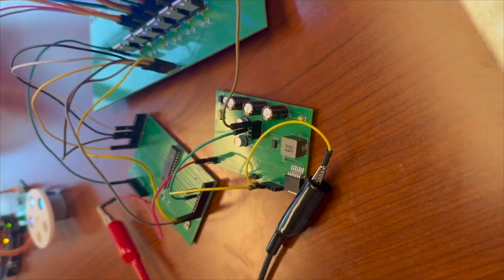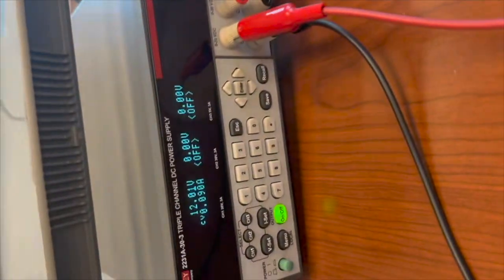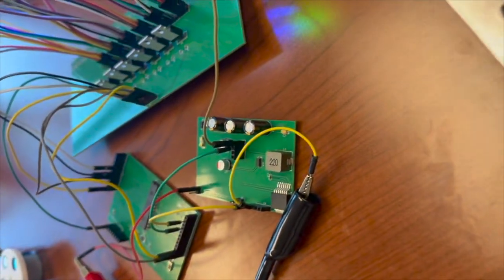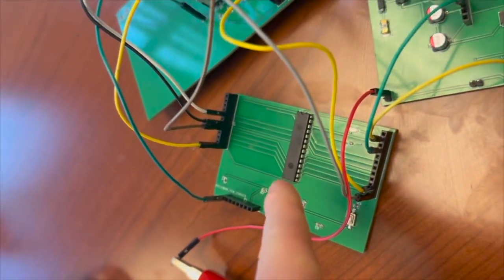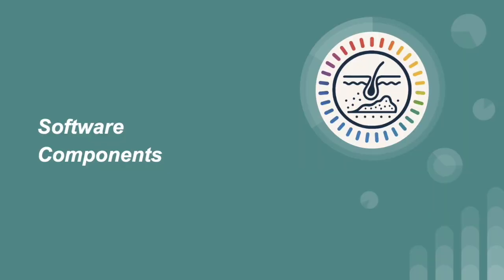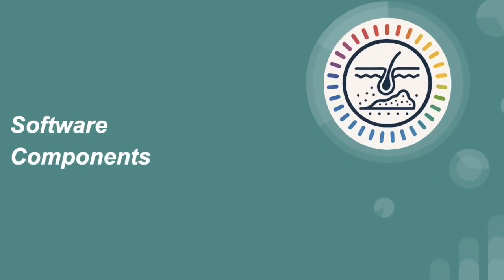The 12 volt is regulated by the buck converter, which outputs a stable 5 volts. This regulated voltage powers the ATmega328, the LED driver board, and the motor board, ensuring reliable operation across all subsystems. And moving on to software.